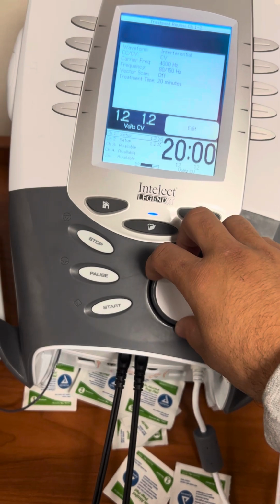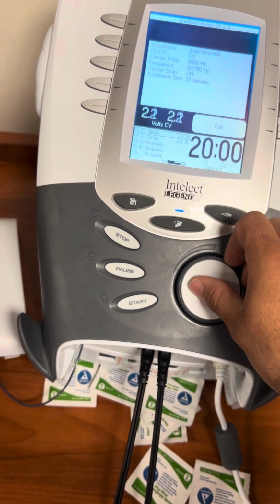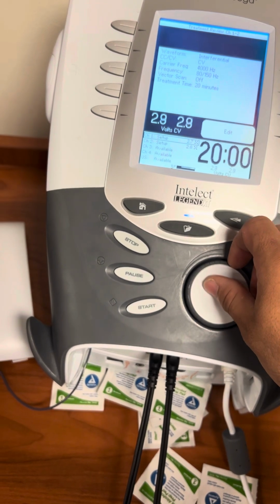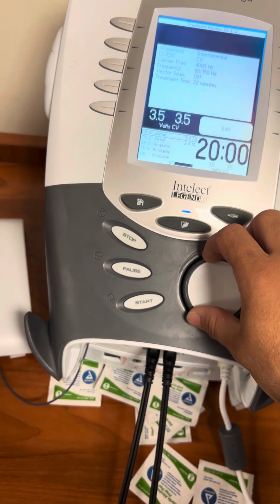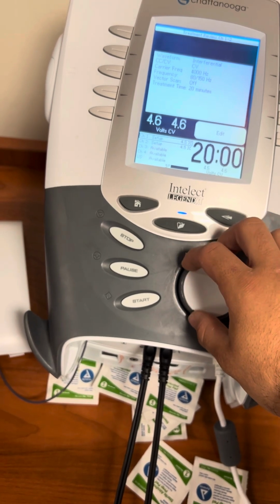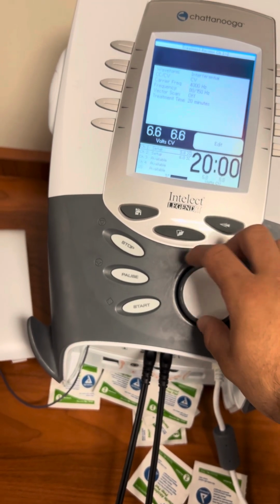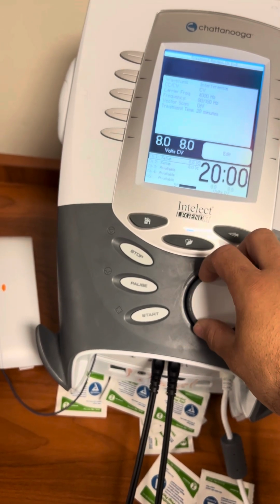From here, what we're going to do is turn the knob not too fast. We're going to ask the patient to tell us when they feel some sort of sensation, like they're feeling pins and needles, and then we're going to go up to the point where we want it to be strong but comfortable. We don't want them to be in complete discomfort. So we're going to keep going up as the patient says.